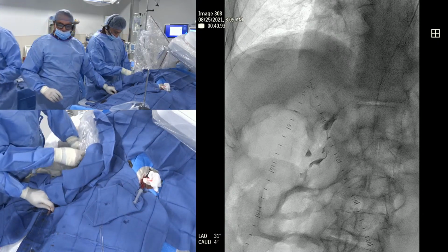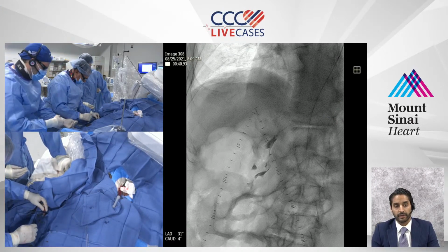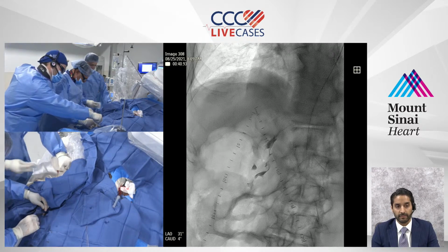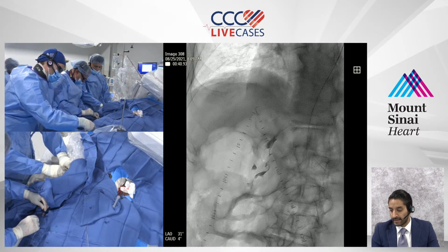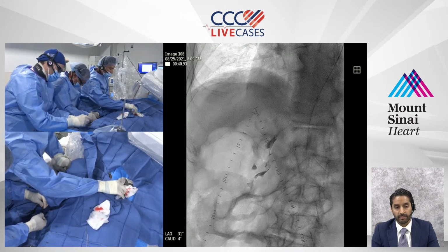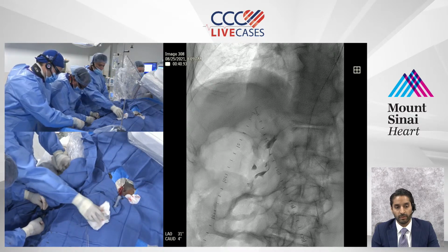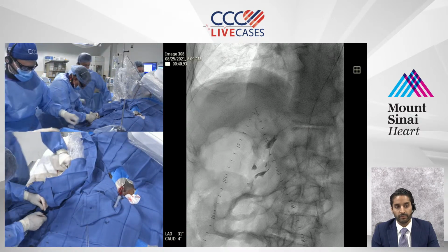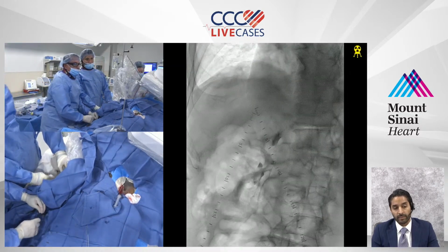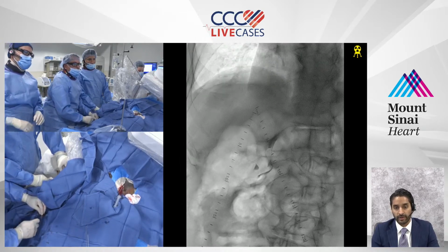Yeah, it's exactly as you were mentioning. It seems as though the iliac intervention planned for today is but one of several steps of several complex interventions. And I think it's a little bit challenging to make a decision today about the best way to proceed. And I'll be very interested to hear your train of thought, considering that we do know that we have subsequent interventions to go. Things to consider from my perspective would be what are the feasible options for alternative access for the other interventions should we have to.